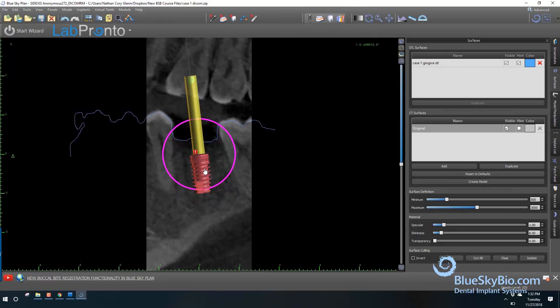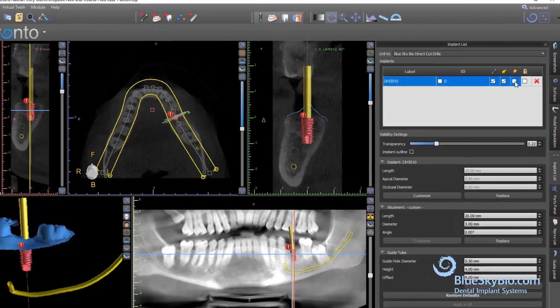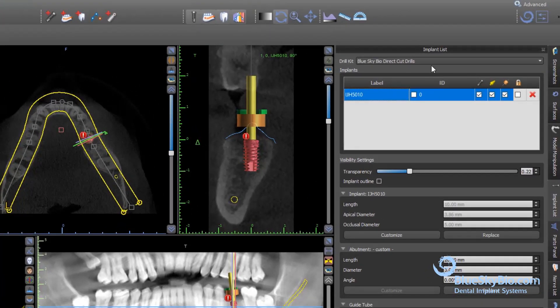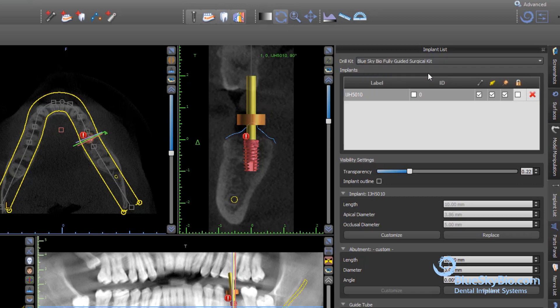Virtually position the implant in the best restorative and surgical position. In the drop-down menu at the top of the implant list, choose the Fully Guided Keyless Kit. This will automatically set all the surgical guide tubes to the ideal position.